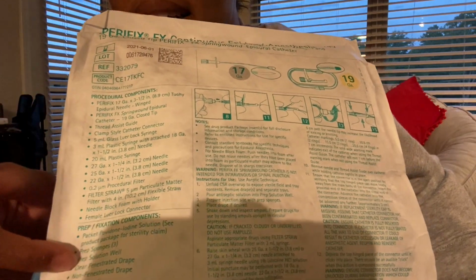So this is an epidural kit. It has the date of expiration, and then also in the front, which is really nice, it has everything that is in the kit on this side, listing everything you can find inside. It also has instructions for use and other things like that. So yeah, it's nice to read this over in your free time so you can have an idea of what's in here.